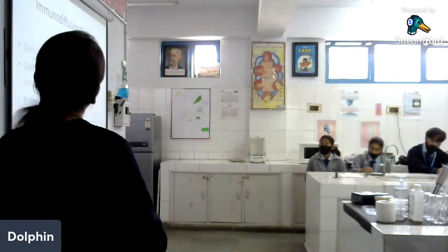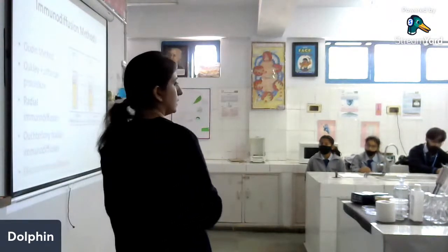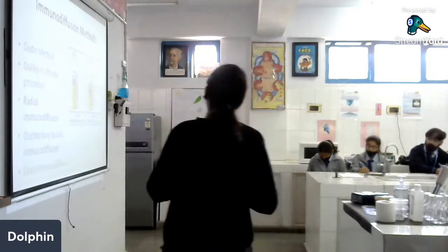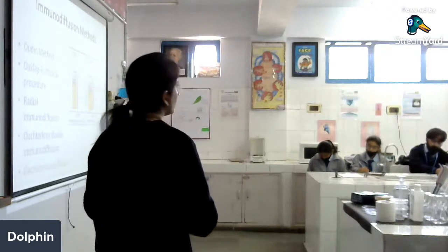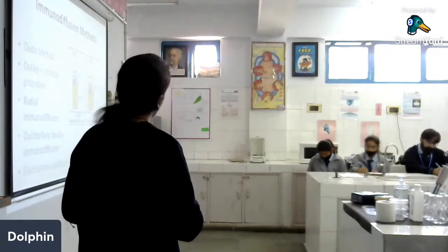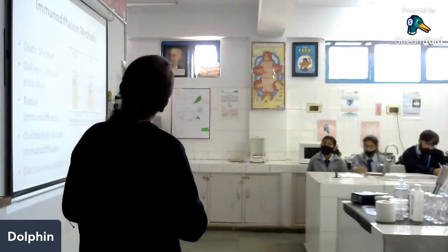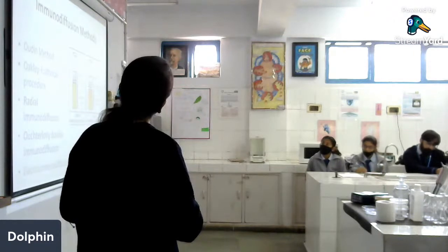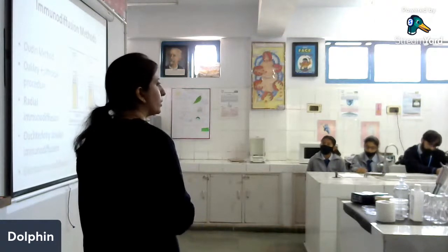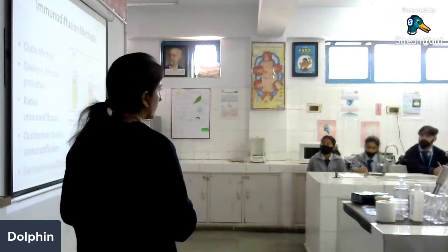Oakley-Fulthorpe method, Oakley-Fulthorpe procedure is double immunodiffusion in one dimension. So because it is double, you will allow both of them to move. So again, we prepare the gel. We add antibody. We layer it with another agar gel, which is plain. Plain means you don't add antibody or antigen to it. You just layer it on the lower gel, right?